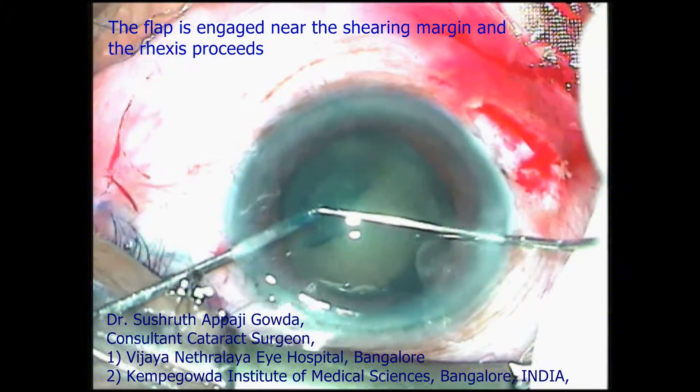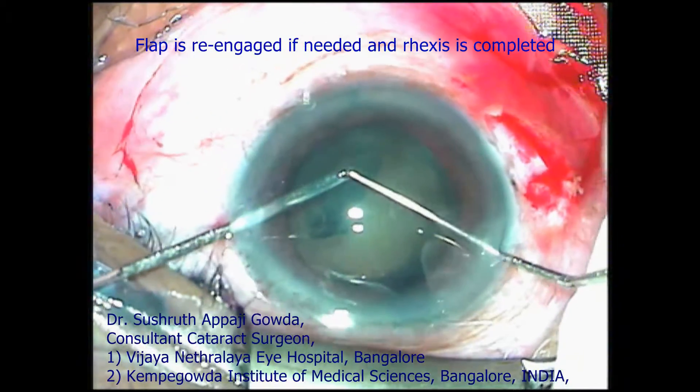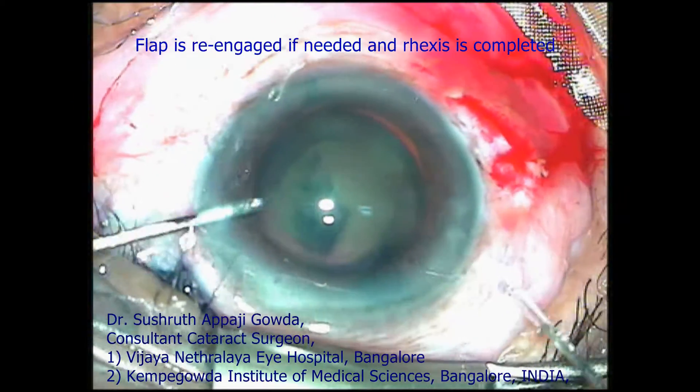The platform engages the flap from below and the rhexis hook engages the flap from above. The flap is caught and the rhexis proceeds. The flap is re-engaged if needed and the CCC is completed.